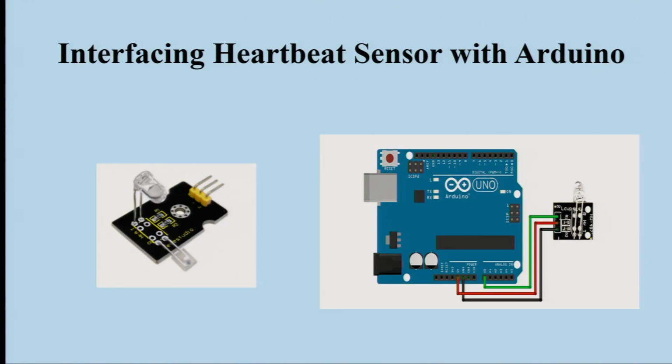On this sensor, this particular portion is where you will put your finger, and it will keep on counting your pulses per second or per minute, which you can see on the plot itself. Depending upon what conditions you have created in your software code, accordingly it will keep on displaying information on your serial monitor or serial plotter. Till now, in a variety of experiments we have used the serial monitor for displaying your readings in the form of numbers. In today's experiment, we are going to use the serial plotter to show the analog waveform that we will get with the help of the pulse rate.